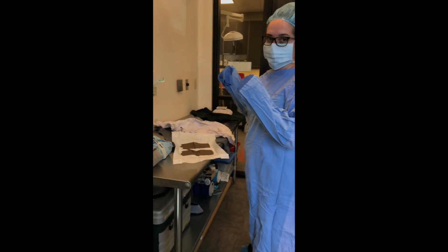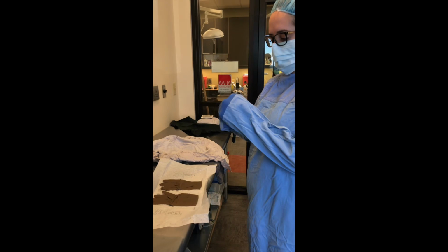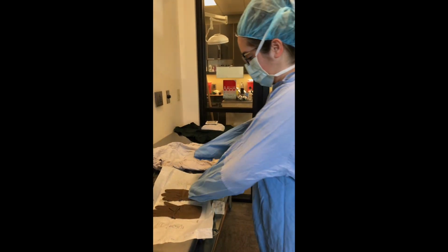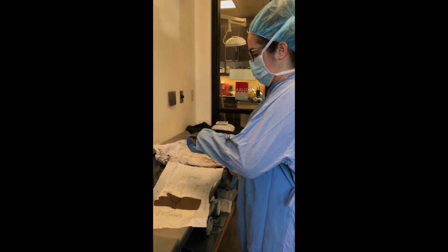Okay, if you want to get close and show this, with my fingers still in the cuffs, they never leave the cuffs, I'm going to close the glove.